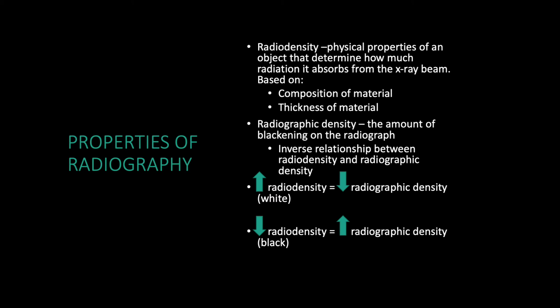So really, we're looking at principles of radiodensity, or the physical properties that an object has as it absorbs the X-ray beam. Depending on the composition of the material and thickness of the material, it'll generate a picture on the film. So here we're talking about radiographic density.